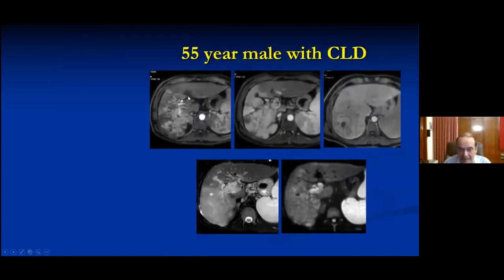This is the arterial phase, showing you a lot of enhancement in the arterial phase.